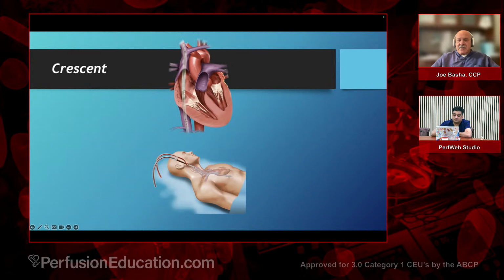In both of the cannulas, you want the return to be anterior and the access to be posterior in this configuration. This is proper placement so that this exit port is rotated medially, towards the tricuspid valve.